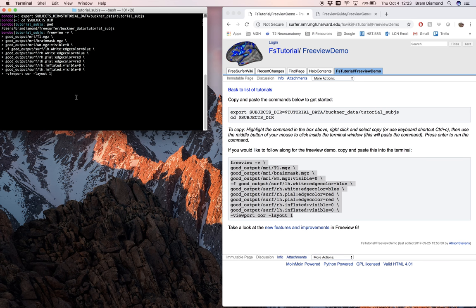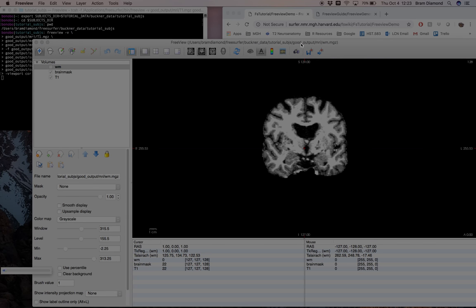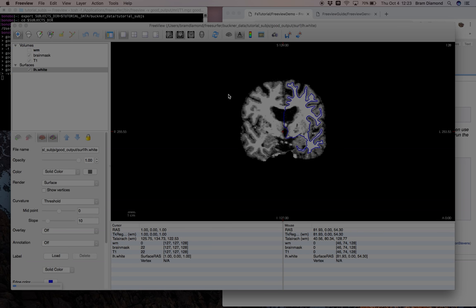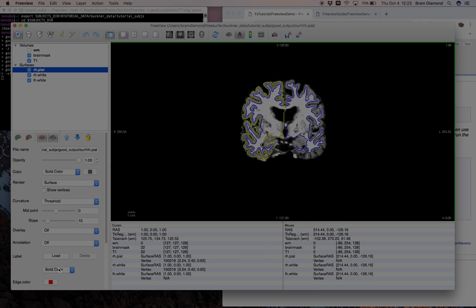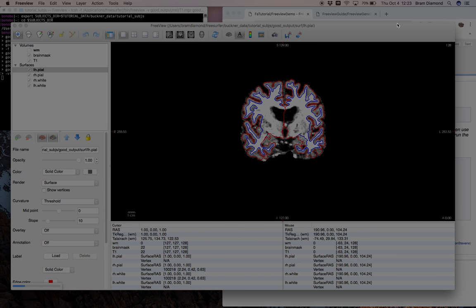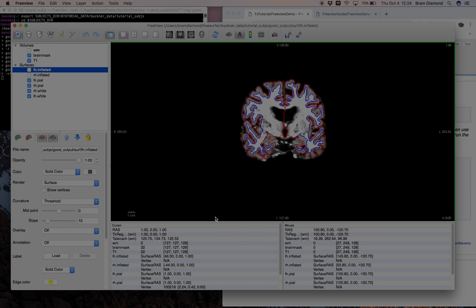Now press enter to run this command. The surfaces may take some time to load, but you can see the progress in the bottom left corner of FreeView. Once everything is loaded, you should notice four different quadrants: the top bar with editing options, layout options, orientation, and more; the main viewport showing the brain mask volume with surfaces rendered on top; the information panel underneath showing cursor coordinates, intensities, and labels; and on the left, the loading toolbar and control panel with a list of loaded volumes, surfaces, and adjustable parameters.